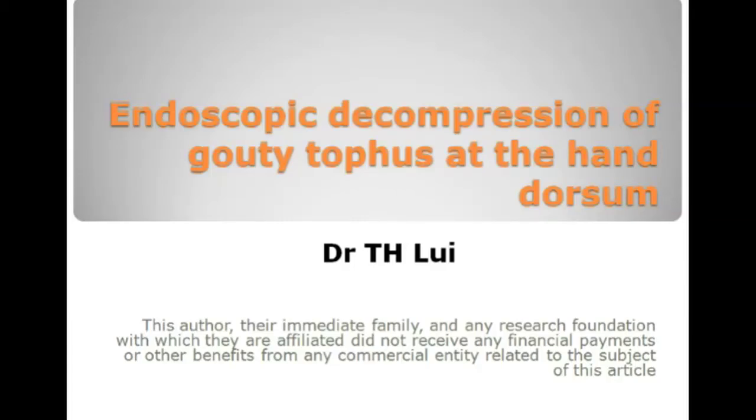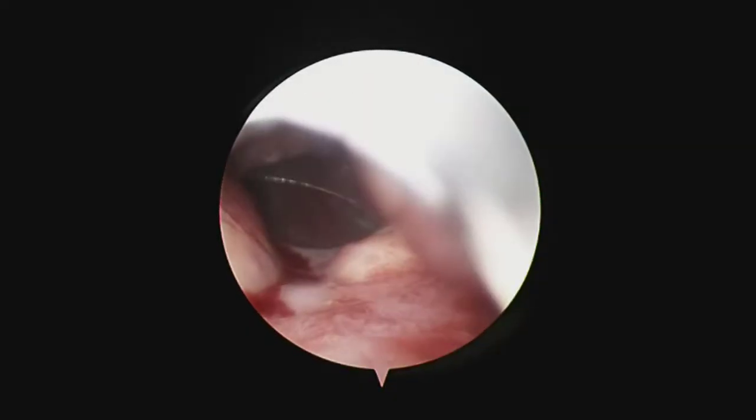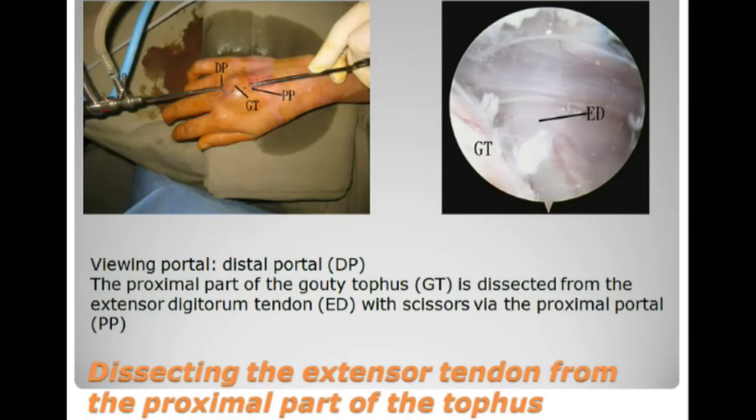Endoscopic decompression of the tophus of the dorsum of the hand. This is performed through the proximal and distal portal. The first step is dissecting the dorsal surface of the tophus, which is the working area.